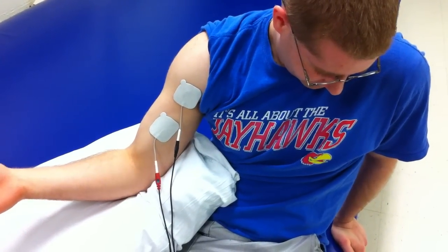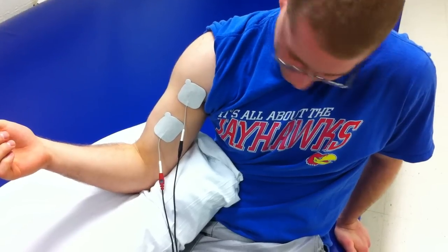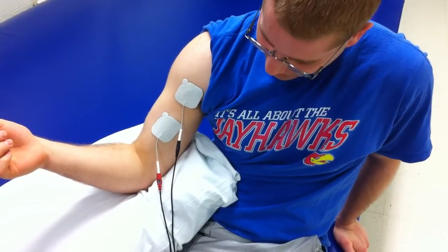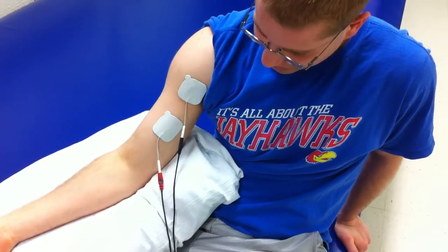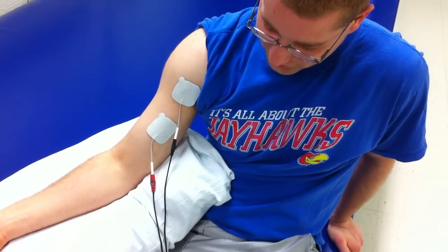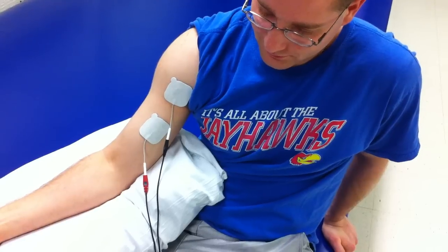There's 10 seconds on. Sometimes with this you can have the patient assist with the motion so he could come all the way up just to get more muscle recruitment. And now we have 50 seconds of off time so that we don't over-fatigue the muscle that we're targeting.